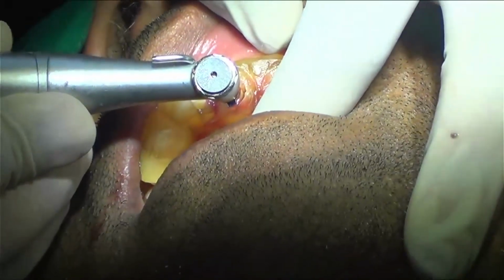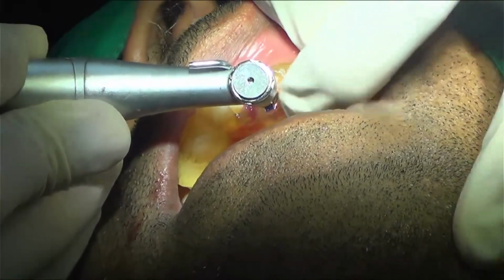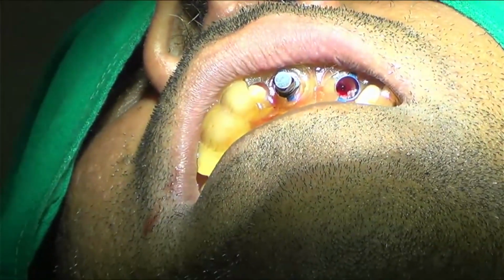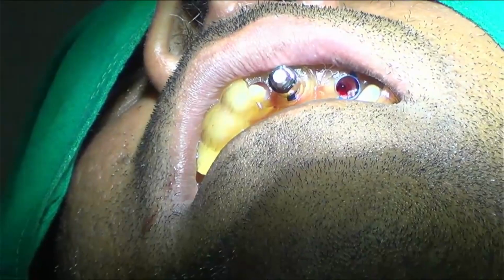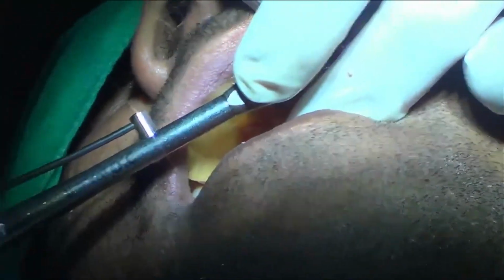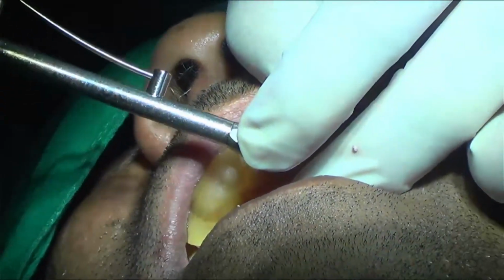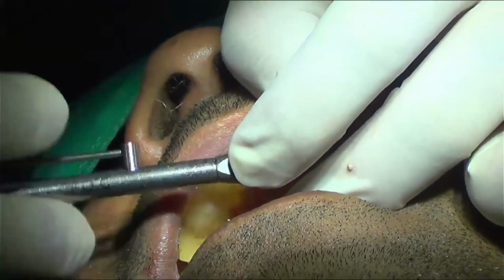So I have already reached my 35 Ncm torque and still I have to go like 1 mm more below. So I take out this and then I am going to use the connector extension and the torque wrench. See, I am at 35 torque. 35, approximately 50 going.